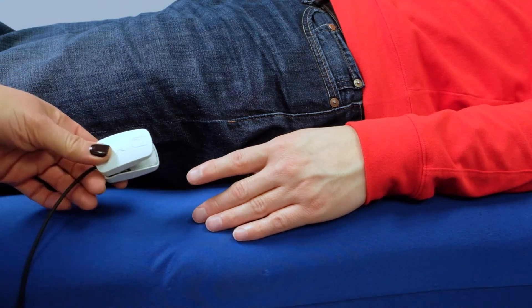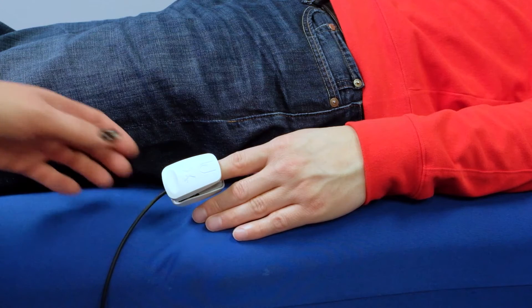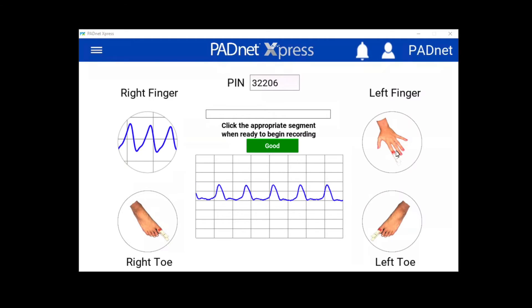To continue the test, place the probe on the patient's opposite finger. Click on next finger to record segment.